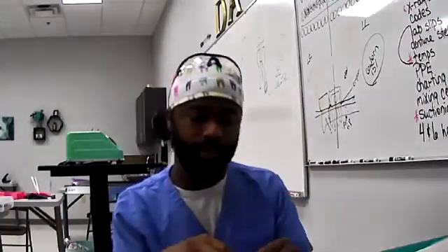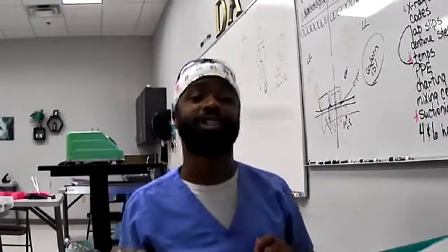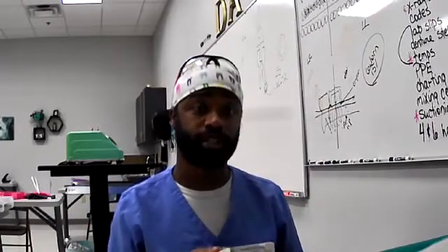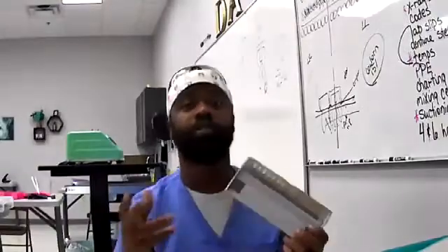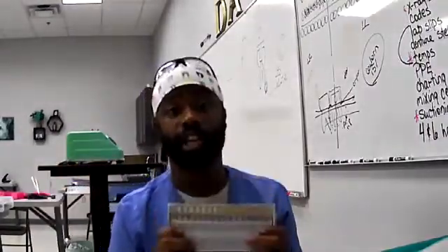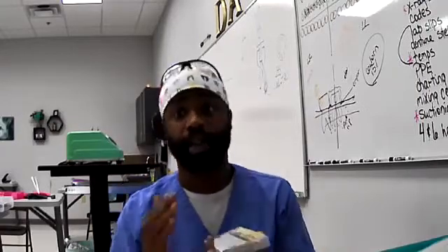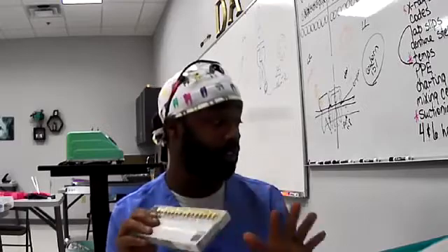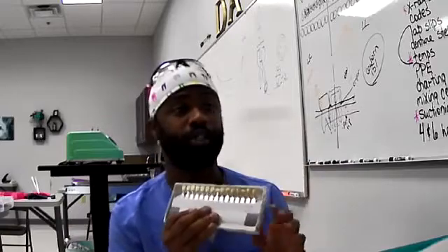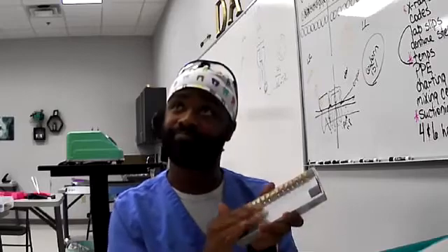It's easy. One of the first steps, I wish I would not have skipped it, but whenever you're doing a composite, and I shouldn't have skipped it because I want you to get into the habit of this. Anytime you're doing a composite restoration, which is the color of the teeth, okay? You want to check the shade. This is called a shade guide, and it goes all the way down from bright to dark, okay? And these are just the universal shades in the world. Always check your shade before doing a composite restoration. Then you can let the dentist go ahead and prep the tooth, so remove the decay and all of that. But try not to ever start a composite restoration or composite filling without checking your shade. It's so much harder to check your shade once you're in there because the tooth is going to look a little darker once you get into it. So just always check that shade.